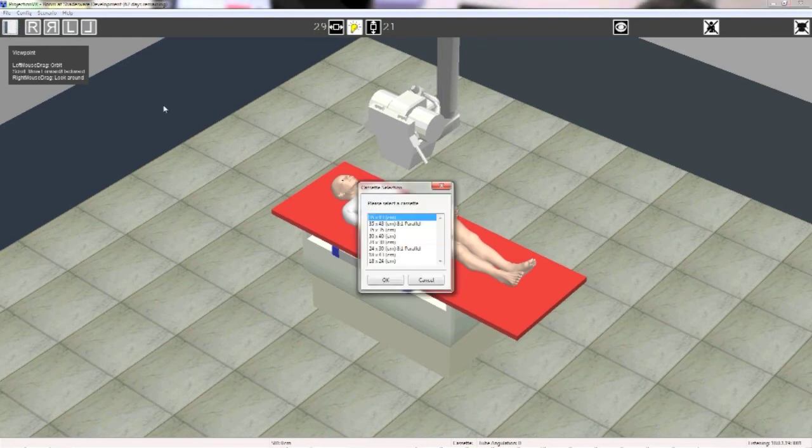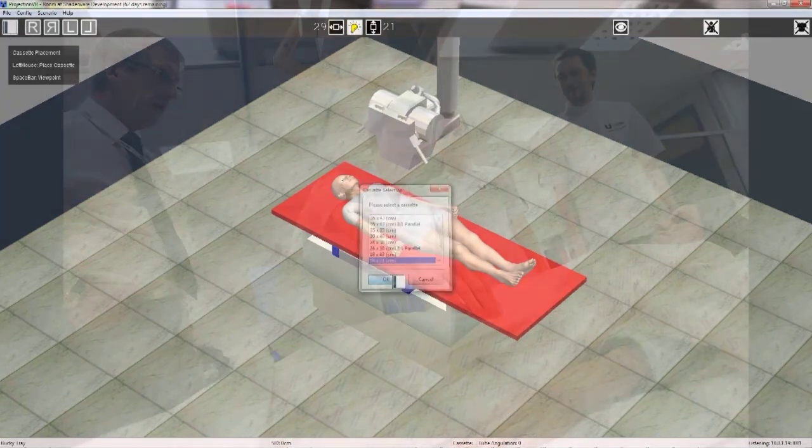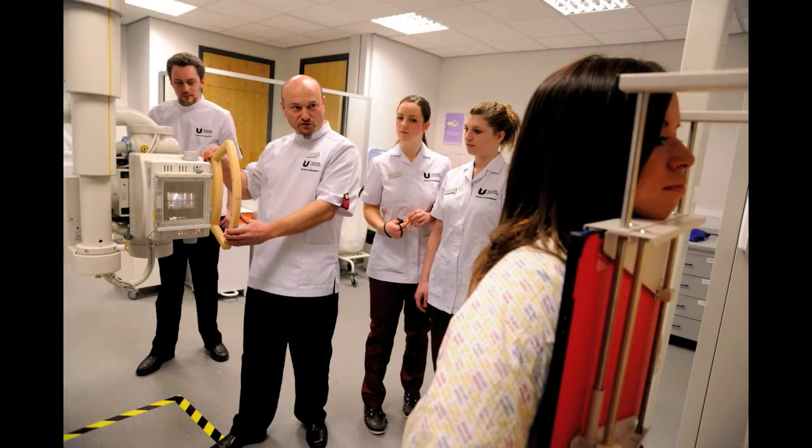This allows the skills lab time to become much more patient-focused, with students practicing manual handling skills, communication skills and infection control drills. Actors have even been employed as models for role play with the money that was saved.